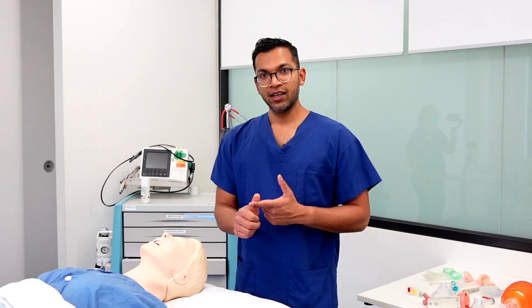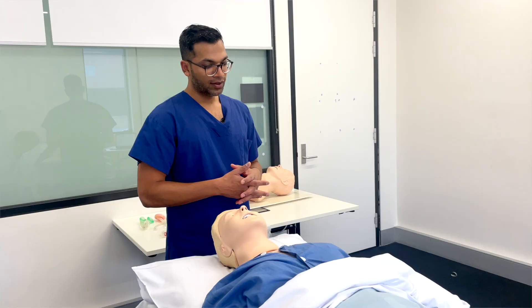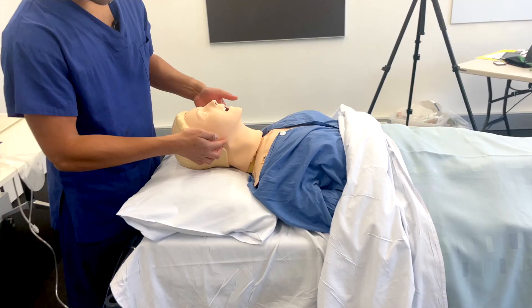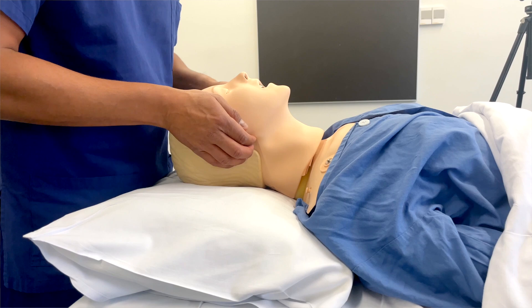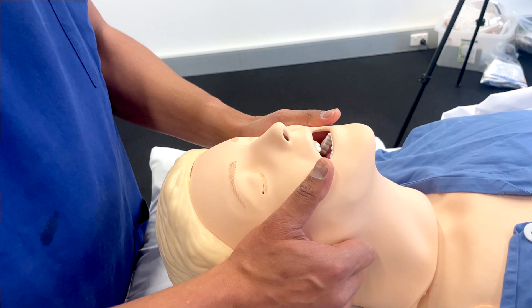The specifics of bag mask ventilation include maneuvers and adjuncts. The three maneuvers commonly discussed are jaw thrust, chin lift, and head tilt — all trying to align those three axes. The jaw thrust is probably the most common technique I use, because it often achieves a head tilt simultaneously. To perform it, place your fingers behind the angle of the jaw — a good tip is that it's right near the ear, as far back as you can go along the jawline — then lift up, moving the jaw and lifting the tongue off the oropharynx to allow air to flow more easily.